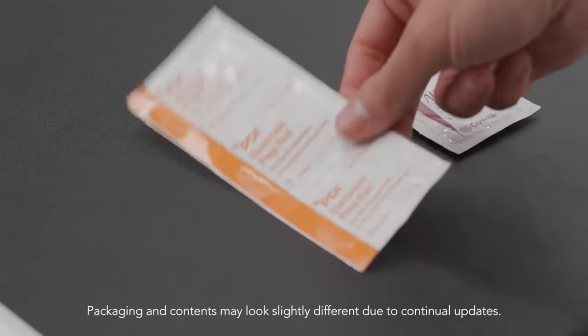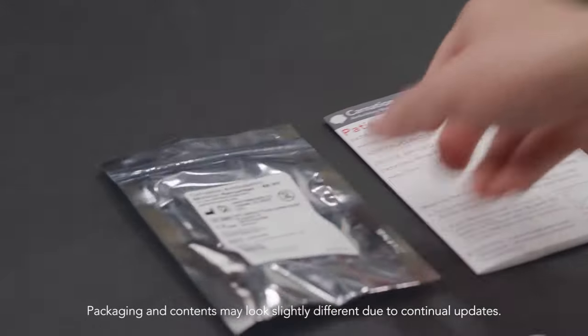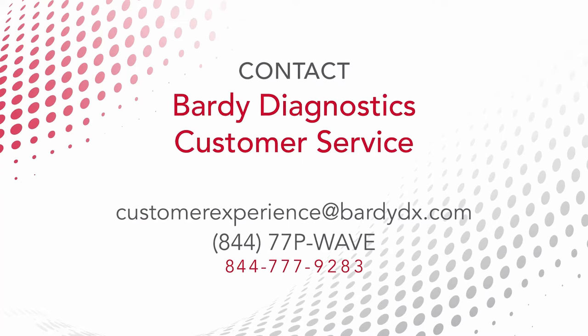Locate a clean area that has a flat and firm surface large enough to lay out the contents of the CAM box. If any item is missing, contact Bardy Diagnostics Customer Service.